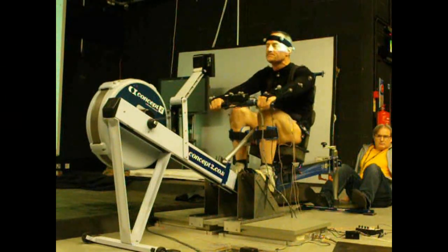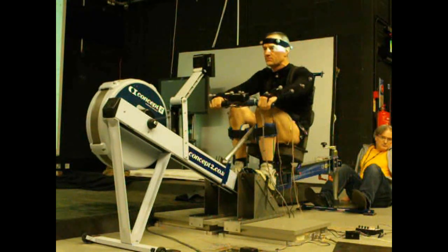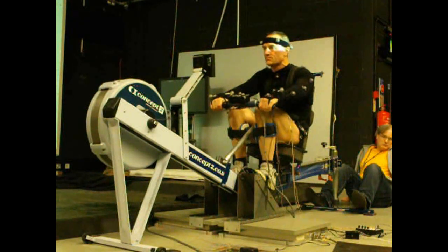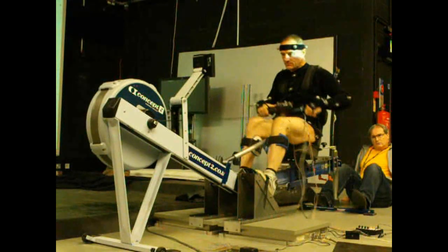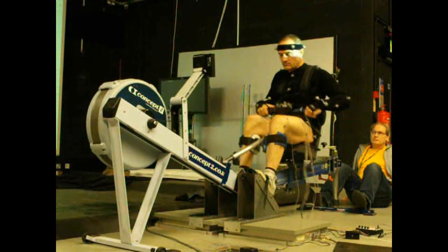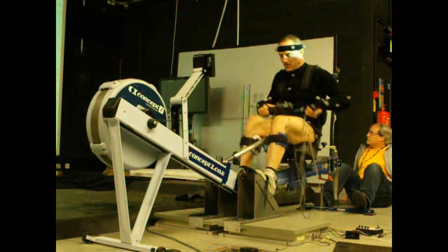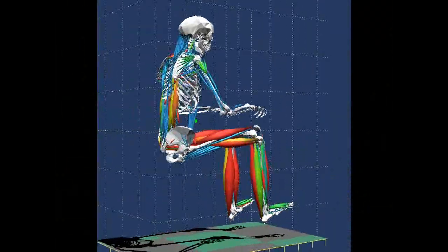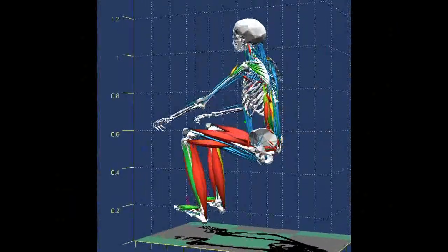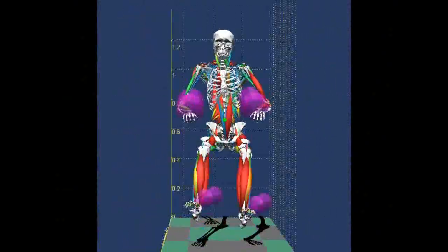This subject is paraplegic — he's paralysed from the mid-chest level down. A major problem with paraplegia is that bone death occurs in the legs because the legs are not being loaded. You might notice his legs are actually moving, and that's because we've attached stimulating electrodes to the muscles to get them to fire and reproduce the rowing action. Through rowing, loads are being applied back onto the bones. The question we're addressing in this research study is: how do we stimulate the leg muscles in such a way that the loads are large enough to prevent bone death, yet not so large that they cause injury to the subject?